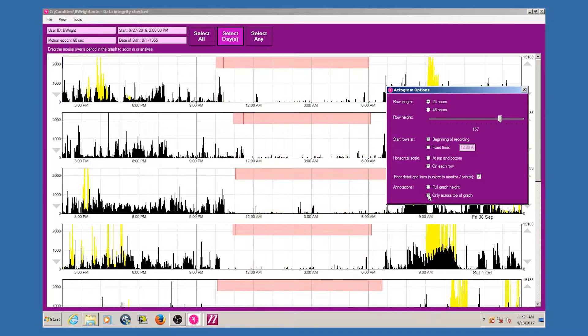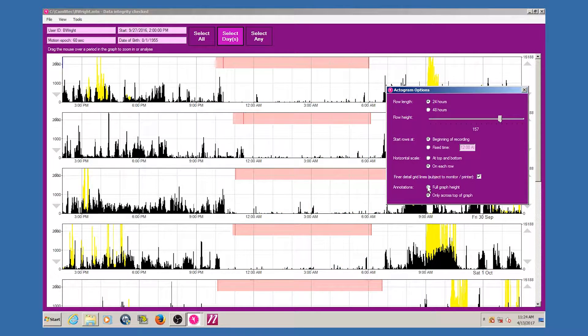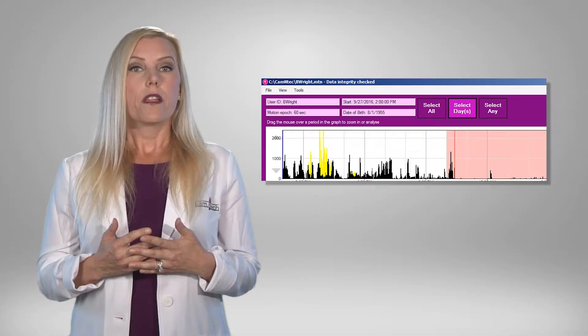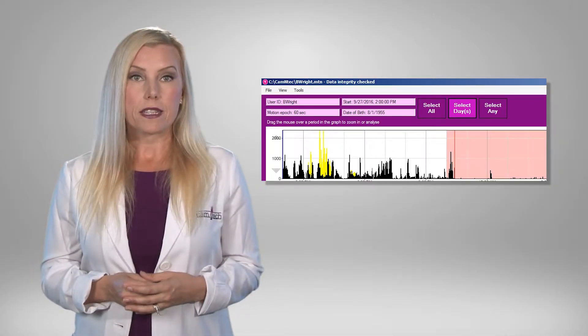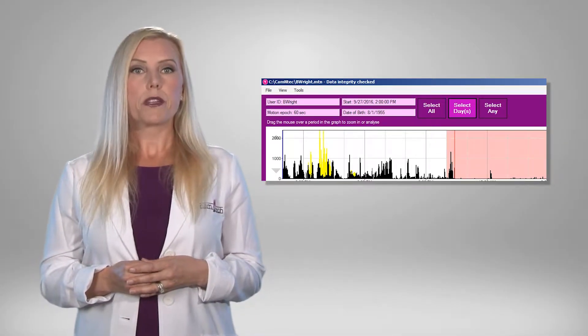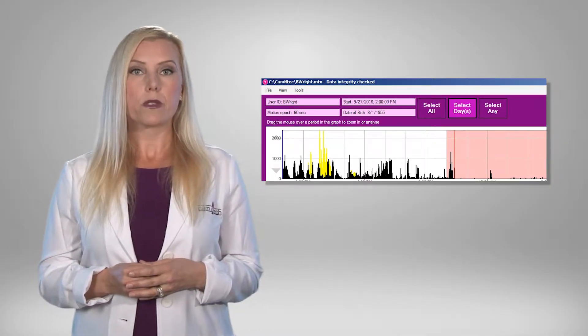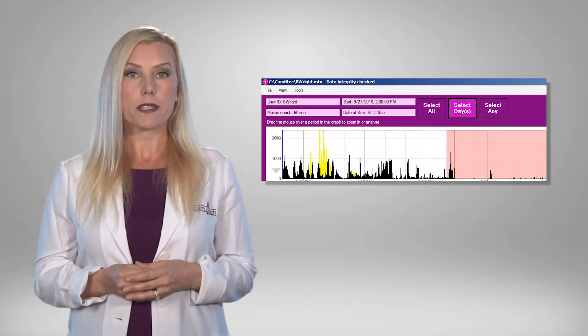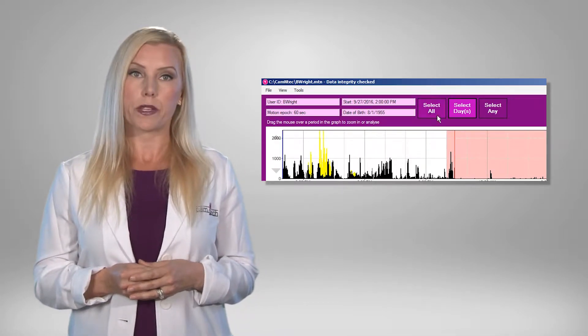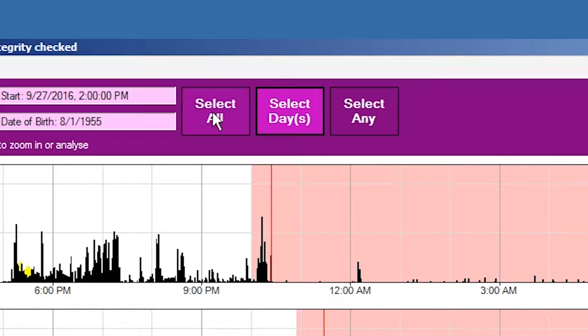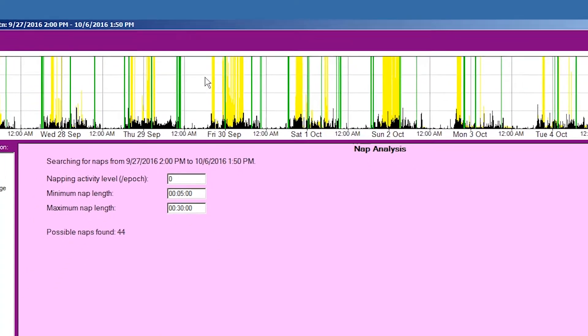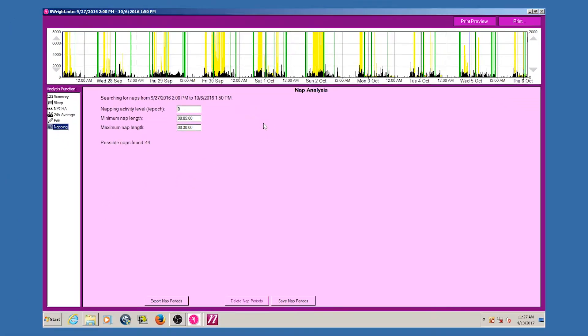There are three main selection options, which may be chosen by use of the control buttons at the top of the motion-wise window. The select all option allows a one-click selection for all days of data ready for a multiple-day analysis such as NPCRA.